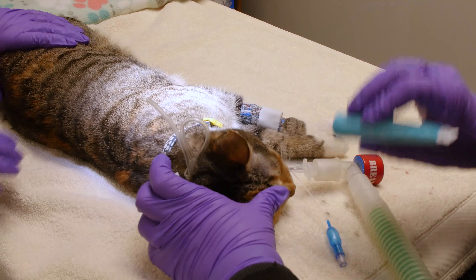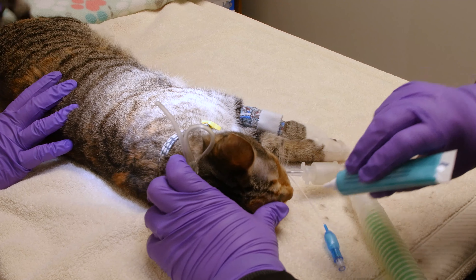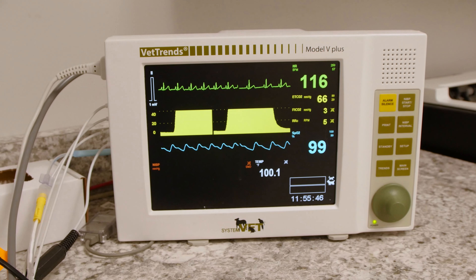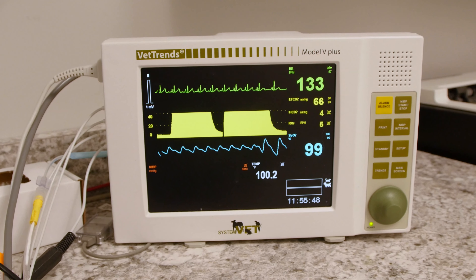We lubricate your pet's eyes while they are under anesthesia, as they are unable to blink. Your pet is hooked up to the following anesthetic monitoring devices. The electrocardiogram, ECG, gives a real-time view of your pet's heart rate and rhythm.